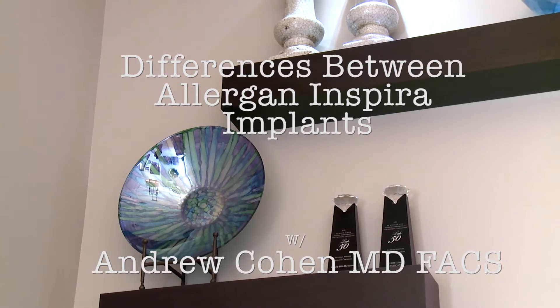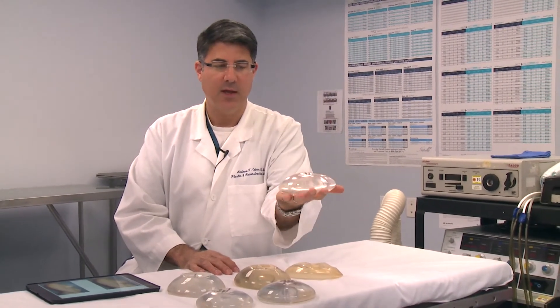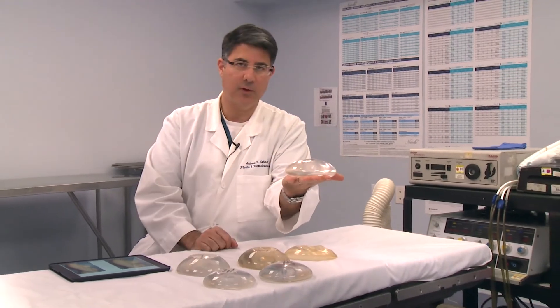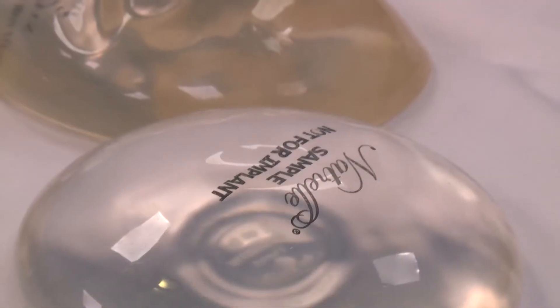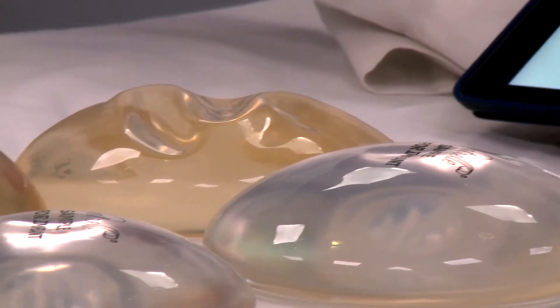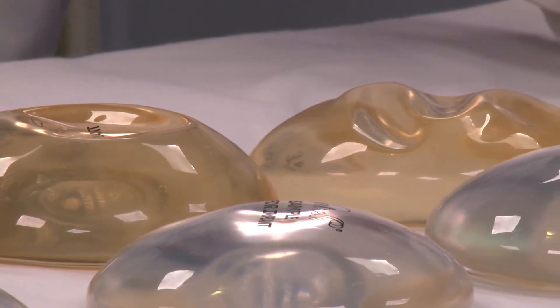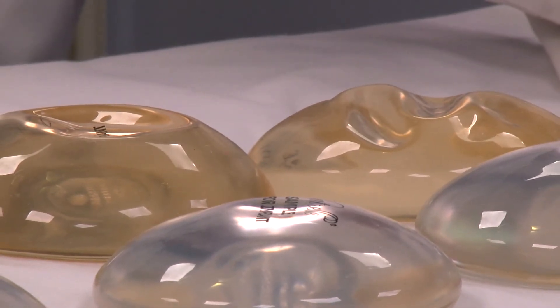What I've done for you is I've shown you in the front row here — these are the new Allergan Inspira implants. Basically, they're filled with more silicone gel now. They overfill that implant. I have really been happy with the Allergan Inspira implants. When you're putting more gel per implant, there's less of a chance of fold-flaw or a palpable implant, especially for thin patients.